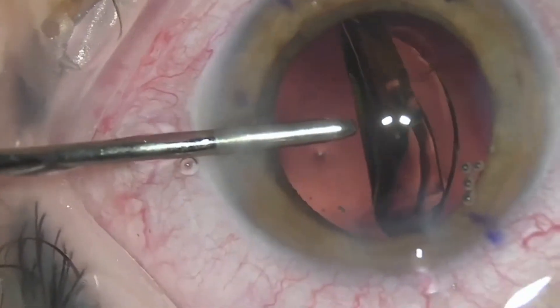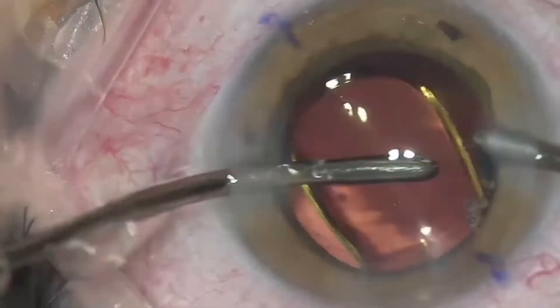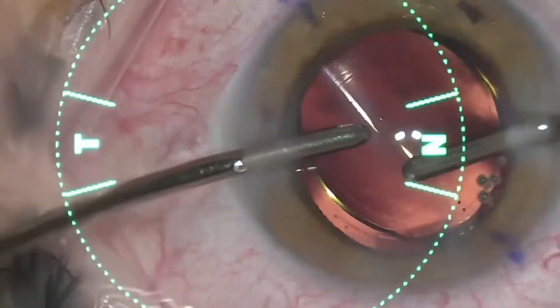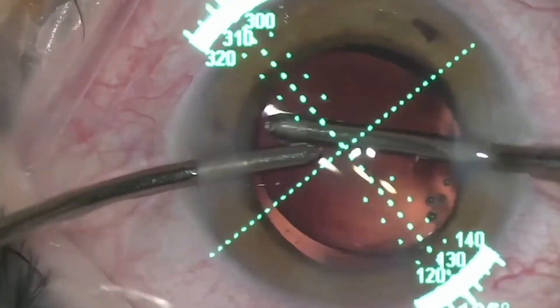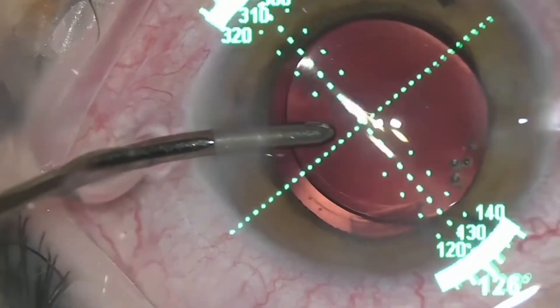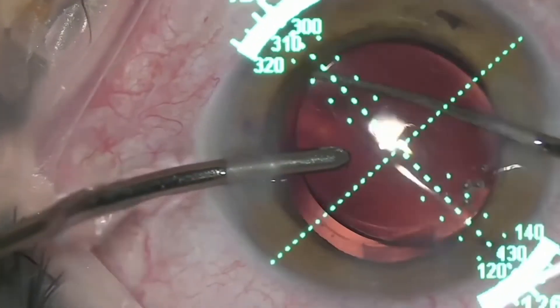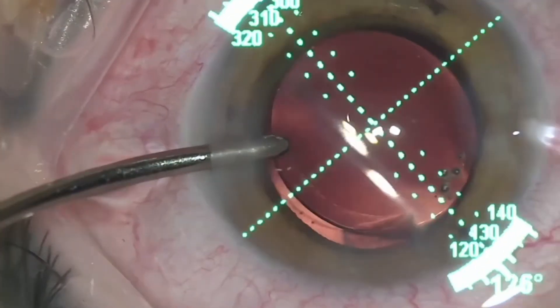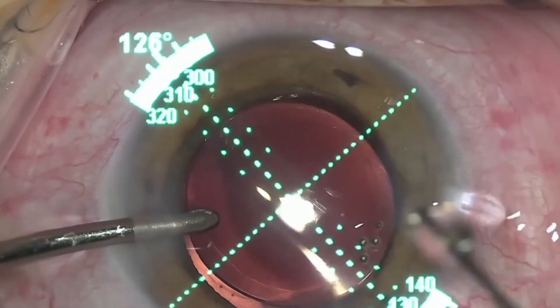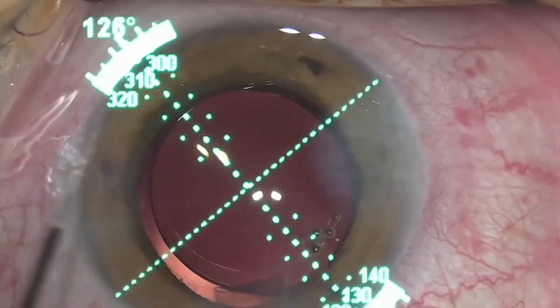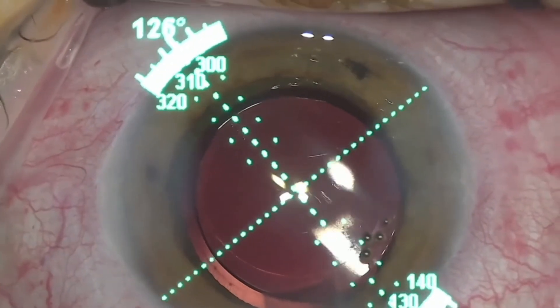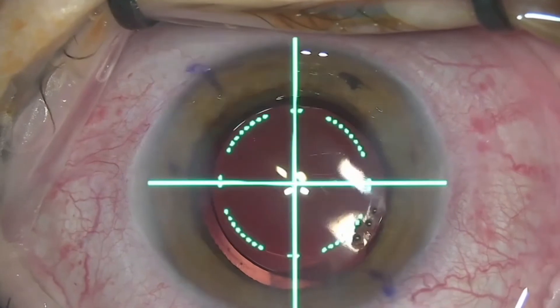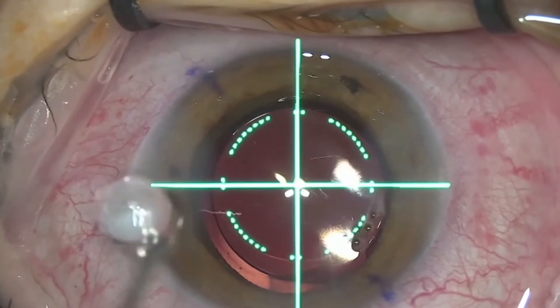As you can see, the preoperative axis was marked using our toric marker or the conventional toric marking. The IOL was placed in the bag using the Verion image-guided system. As shown here, 126 degrees is the desirable axis at which the IOL has to be placed. We then used an online paid software called Pixstar.